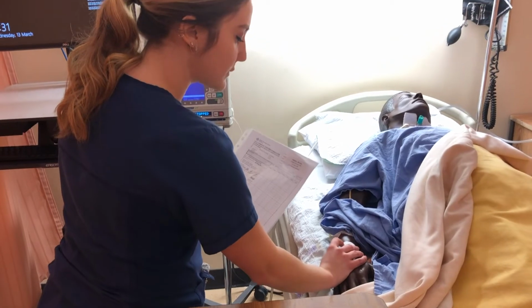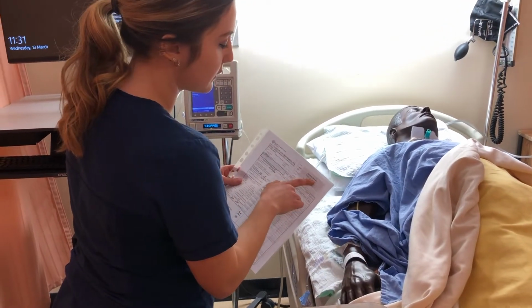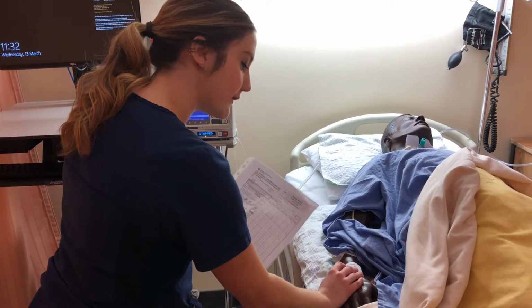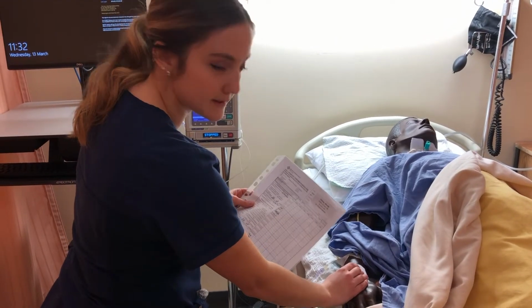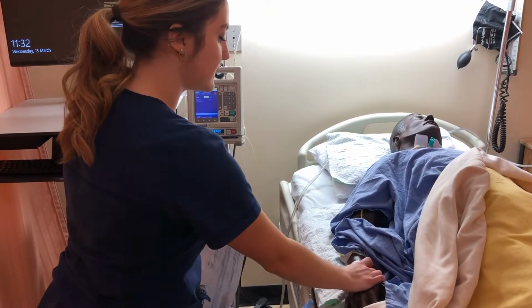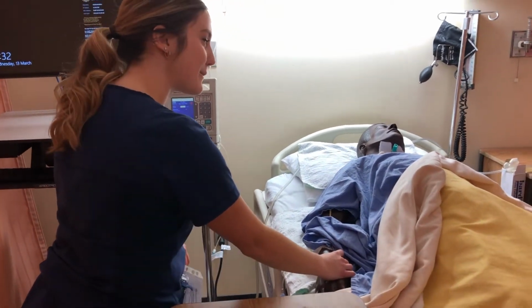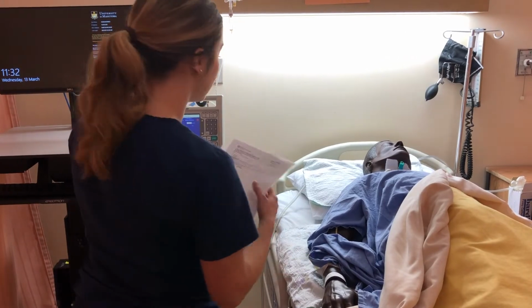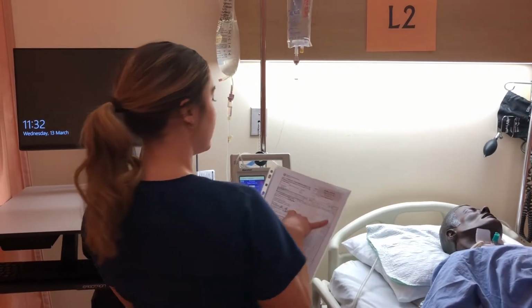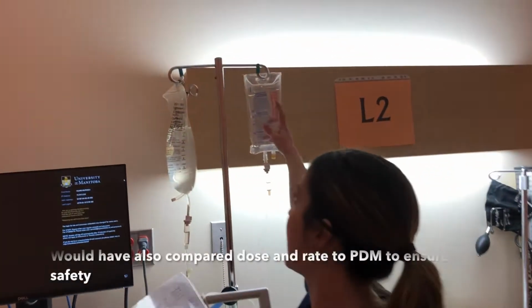So Wendy Holmes is my patient, as it says here, Wendy Holmes. And she is 35 years old. Her FIN is 1, 2, 3, 4, 5, 6, 7, 8, 9. I'm going to get her to tell me her name. Can you tell me your name and your birth date? And it matches this. So now I'm going to look at my MAR, my order, to my heparin that's hanging.